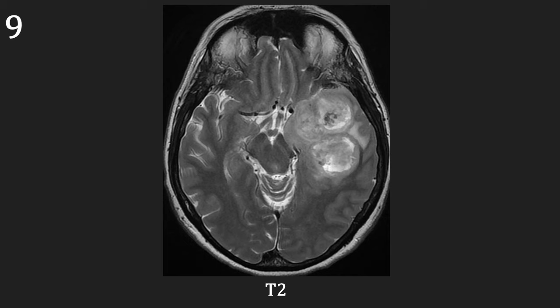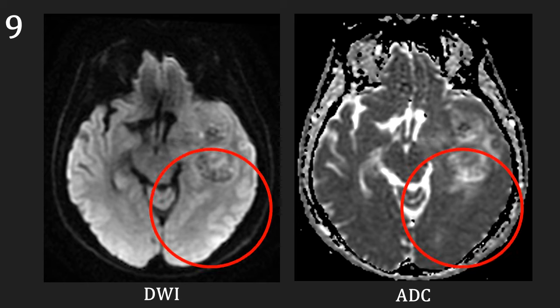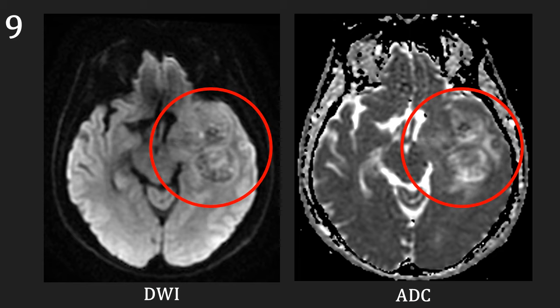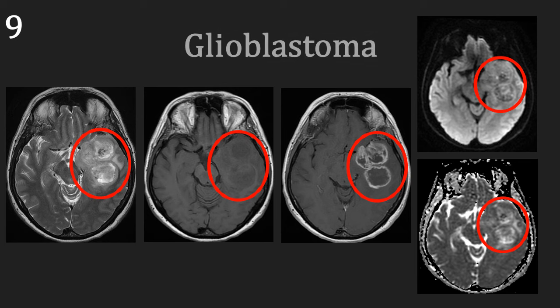Our next case is a 56-year-old female who presented with a headache, a 6-week history of intermittent confusion, memory loss, and visual disturbance. Her family had also noticed a change in her behaviour. There was an abnormality on the CT and this MRI was performed to further assess it. There is a large irregular mass in the left temporal lobe, with no further masses demonstrated. On the pre- and post-contrast images, the single lesion is highlighted with peripheral irregular enhancement. On the DWI and ADC, there is some faint signal abnormality. This is a 56-year-old female with a single irregular mass lesion in the left temporal lobe with peripheral contrast enhancement and mild areas of signal abnormality on the DWI and ADC sequences. On histology, this turned out to be a glioblastoma.